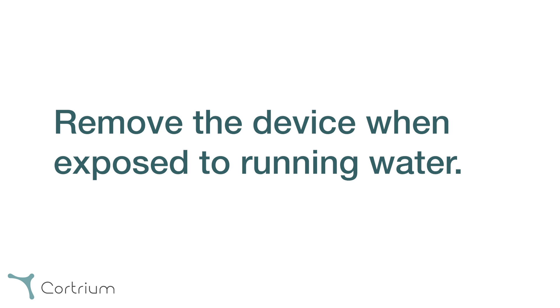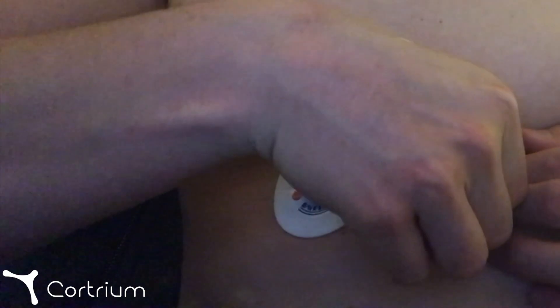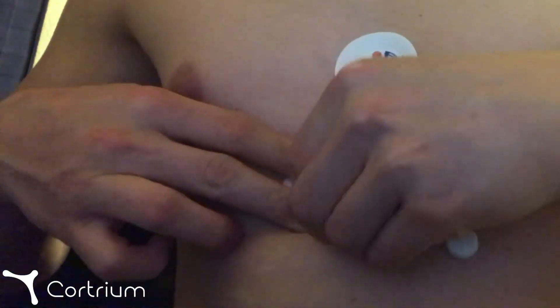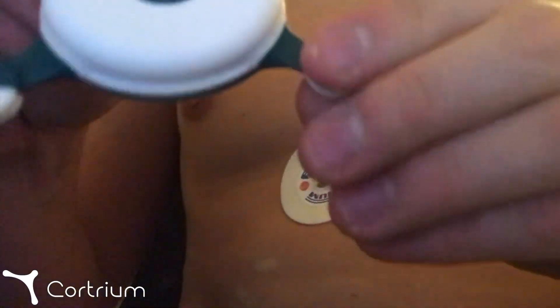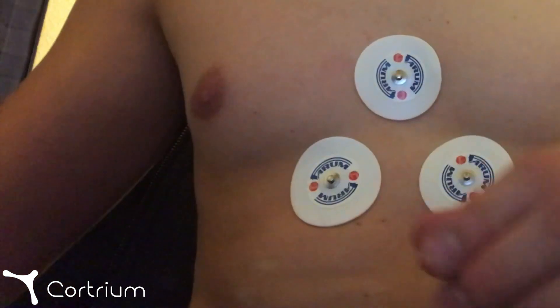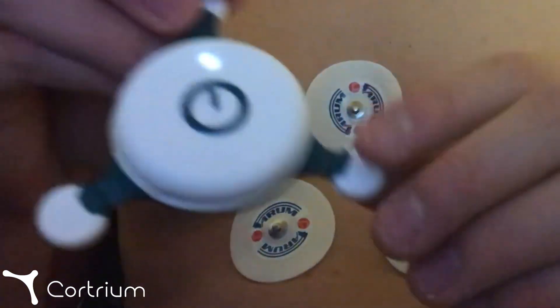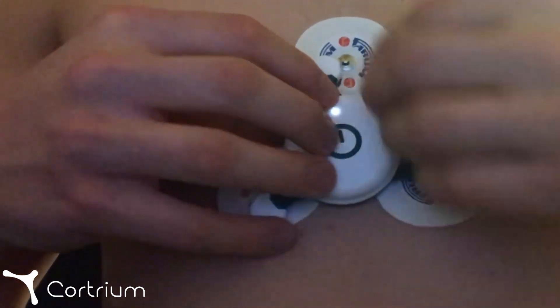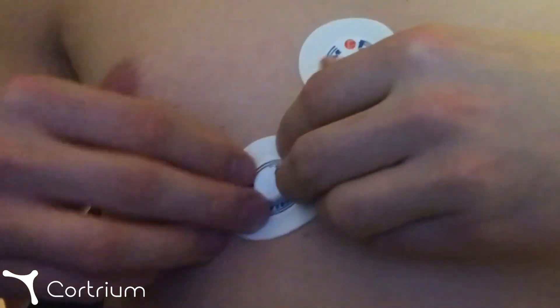Do not remove the electrodes, but separate the device carefully from the electrodes and place it on a dry surface. The device will flash white, indicating that it has no proper contact. Afterwards, you can simply reattach the device to the electrodes, and the device will start to pulse green again.